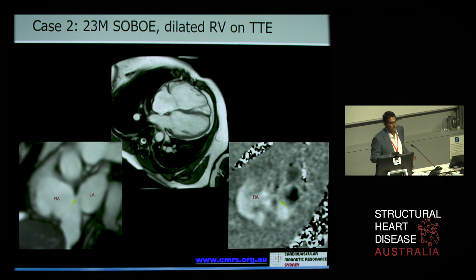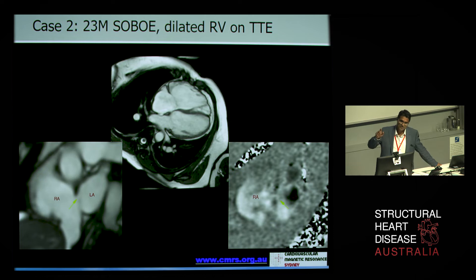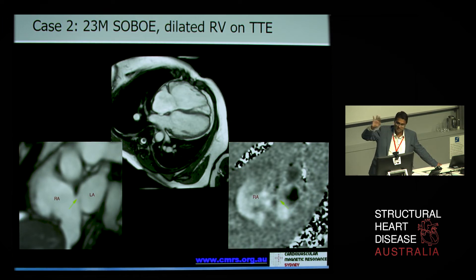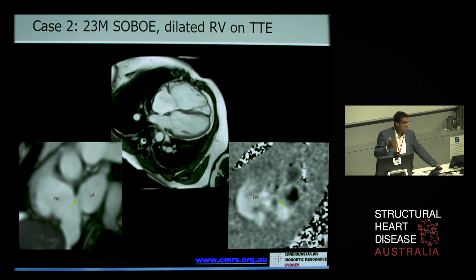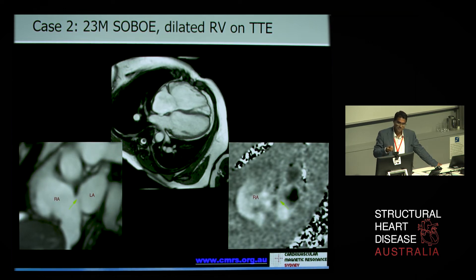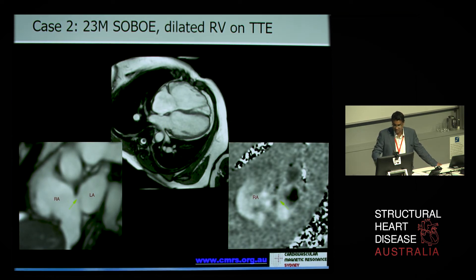It's not often that I'm going to show you where the MRI doesn't do a good job, but it was identified on the transthoracic echo that there was an ASD. In the bottom left panel, you see the right atrium, the left atrium, and this little defect. The phase contrast image on the bottom right is meant to show flow across the atria — pretty hard to see. The best way to image ASDs is with echo, transthoracic or transesophageal. But the question from the echocardiographer was: does this hole explain the significantly dilated right ventricle? And that's where MRI comes in to solve the problem.